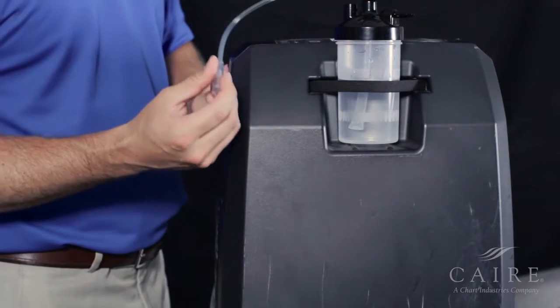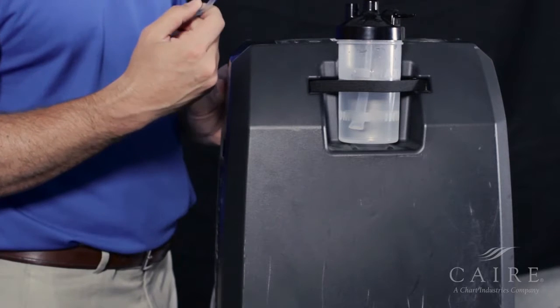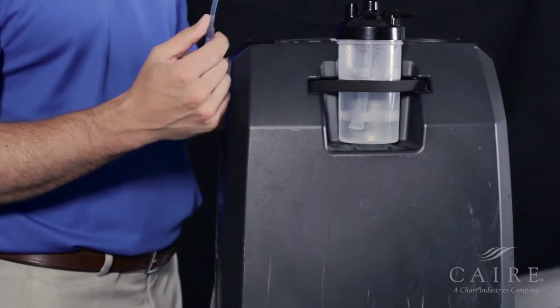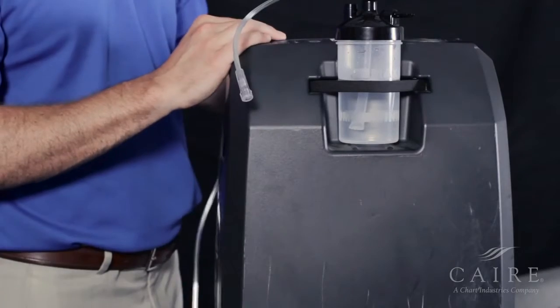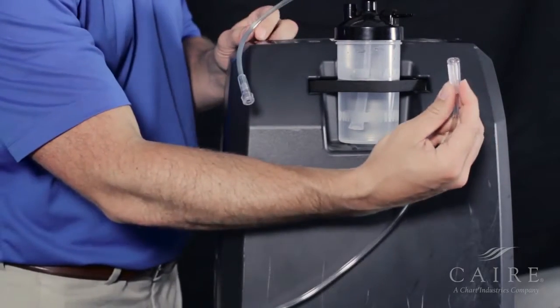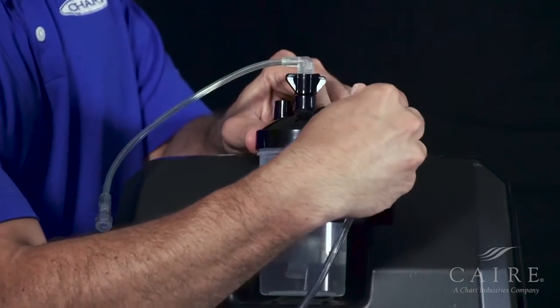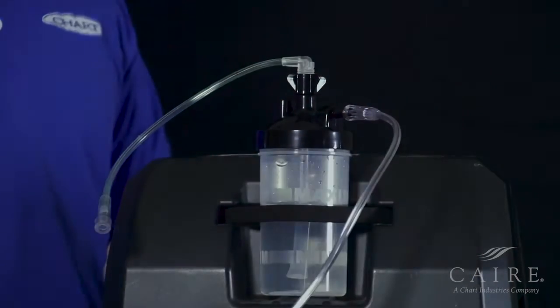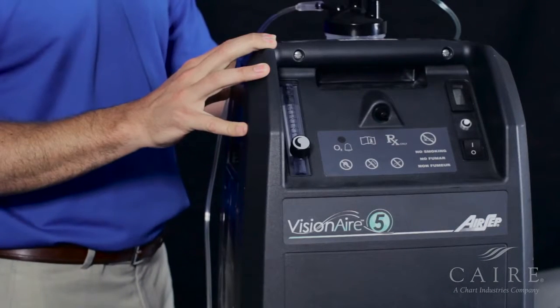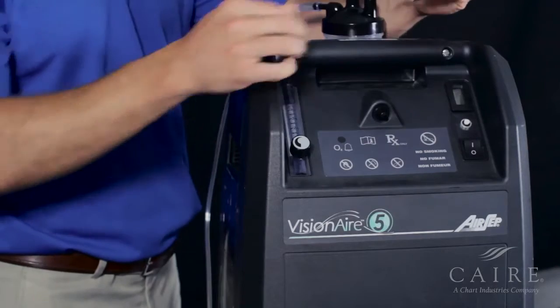Once you've installed the humidifier bottle, go ahead and take the strap that's connected to it and connect it to the front bar. But since we're already on the back side, let's go ahead and hook up our cannula to the back. Simply take your cannula and hook to the male side, like so. The last step of this process is to take the humidifier adapter and connect to the front barb, like so.